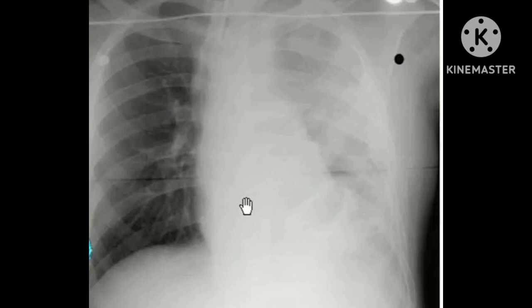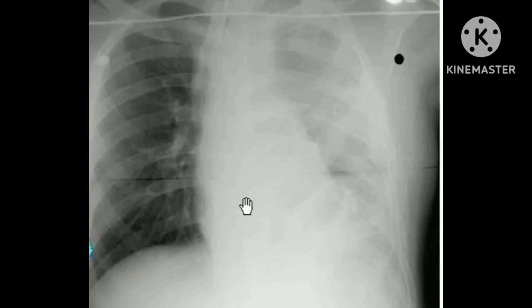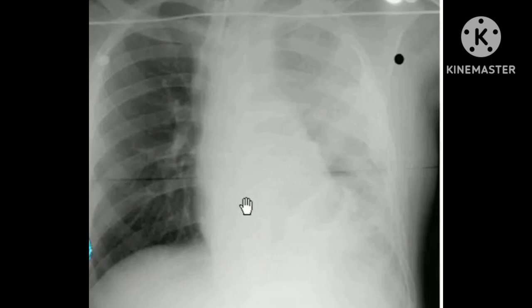This slide shows the left lung is white — that means increased density of the left lung in comparison to the right. In other words, fluid has collected inside the pleural cavity. The fluid may be pus, blood or water — something collected inside the pleural cavity that is denser than air. This is a case of left side pleural effusion. Due to massive pleural effusion, no air-fluid level is seen.